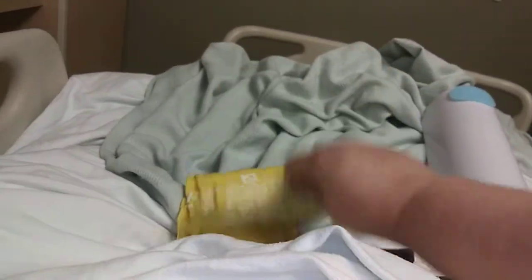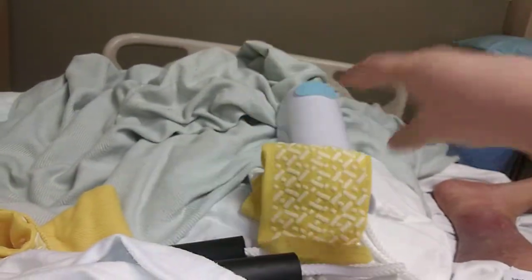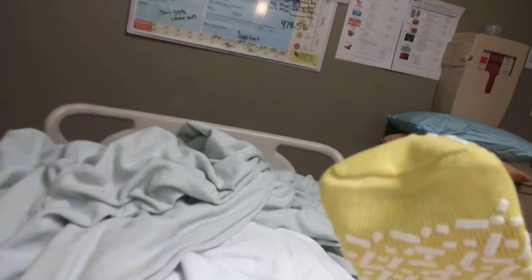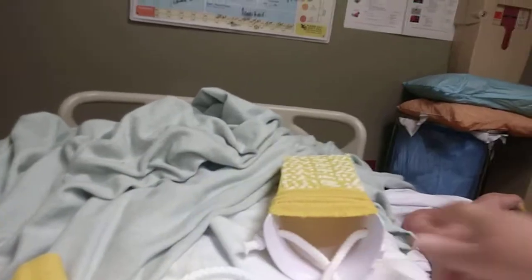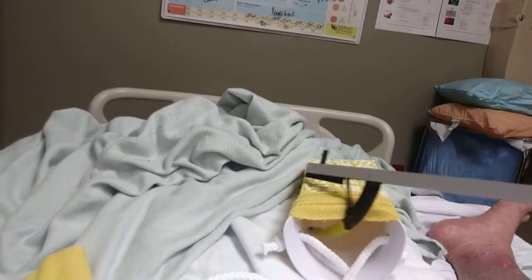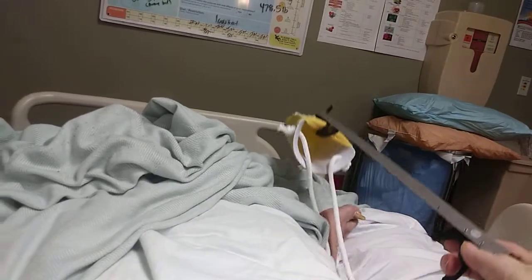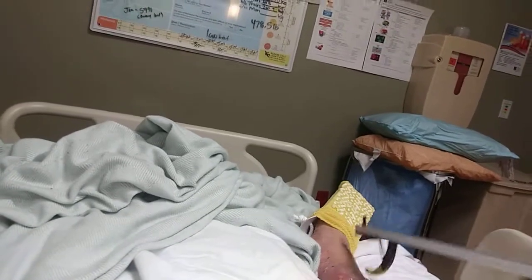I unpackaged them. Now, let me get one out. And then, hold on a second. Okay, well, here you go. This is it with the sock on it. See, you bring it all the way up till it's almost all the way up, like that. And then here's where this comes in handy. Right here. Bam! Let me see here. Okay. Then we put it down here where my foot is. Like so. Oops, let me see. Like so. Like this. Gotta get my feet in between the ropes. And then like that. And then pull this out.